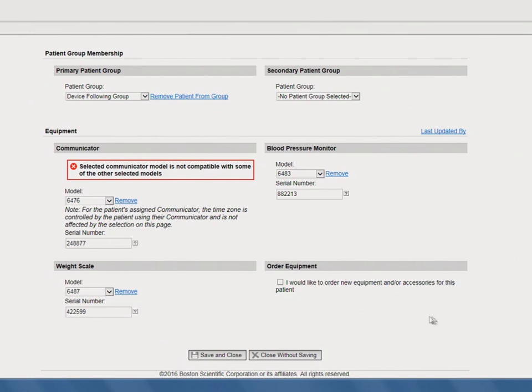Simply check the box next to "I would like to order new equipment and/or accessories for this patient" and click Save and Close. This will take you to the e-ordering page where you can place the new communicator order. The new communicator model and serial numbers will auto-populate in Latitude Next for this patient when the communicator has been shipped.